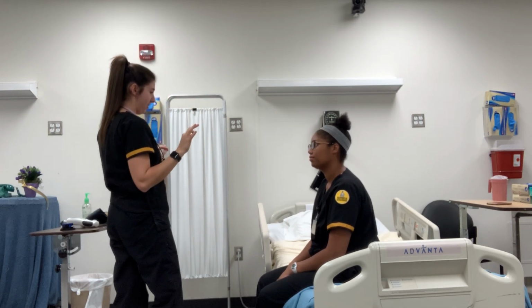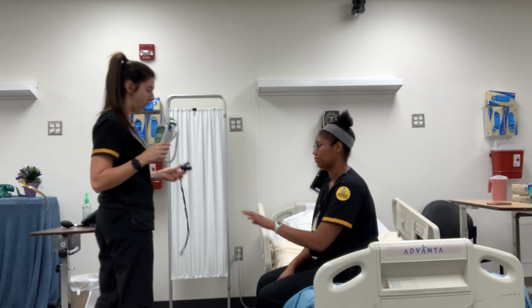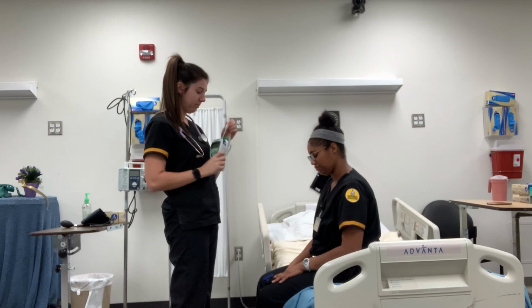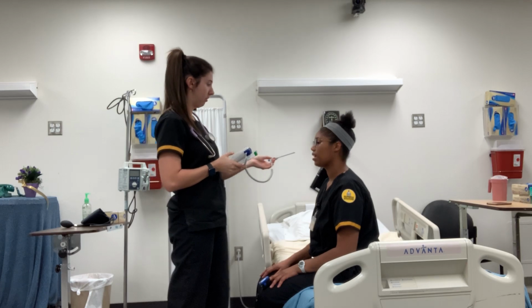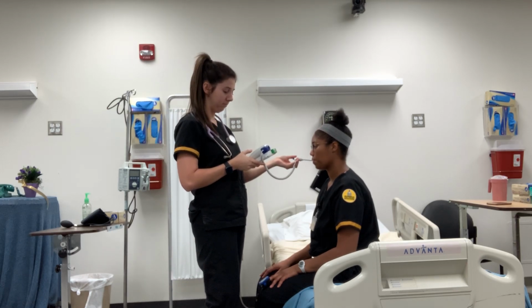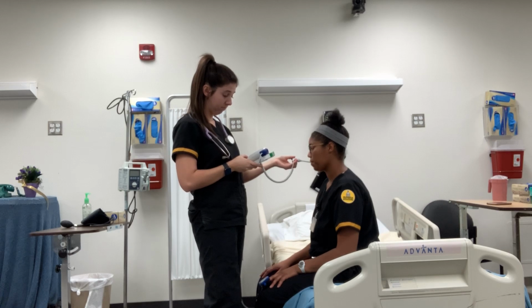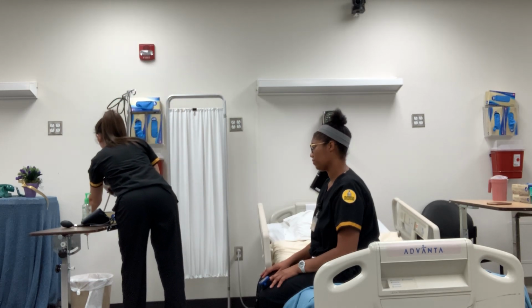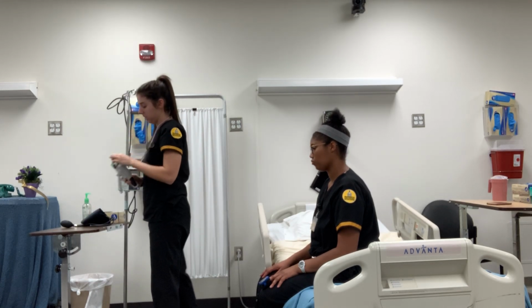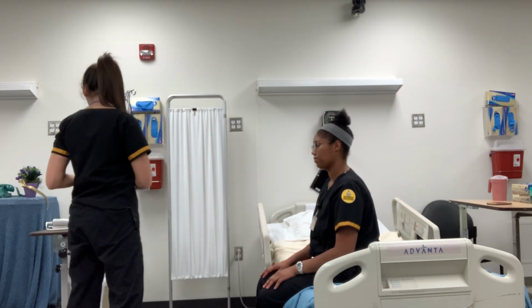I'm going to go ahead and start taking your vitals. Okay. I'm going to start off by putting on pulse ox on your middle finger. I'm going to take your temperature. Put this under your tongue. Alright, and your temperature is 97.7, which is in normal limits. And your pulse ox is 97, which is also within normal limits.